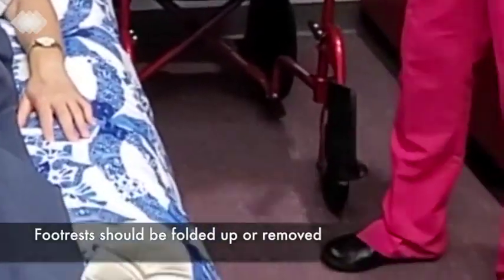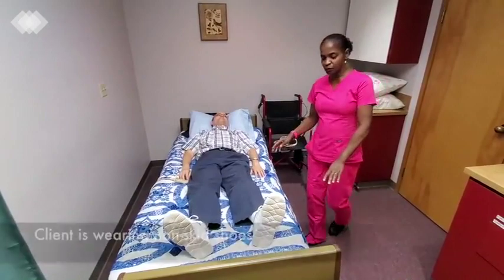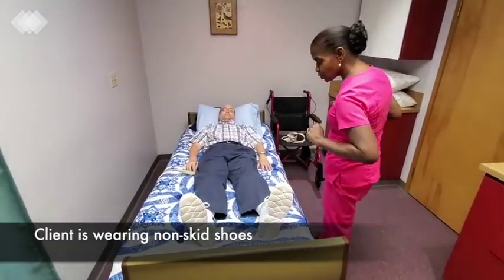And then I'm going to have you sit up. But before I do, I notice that you have your non-skid shoes on.